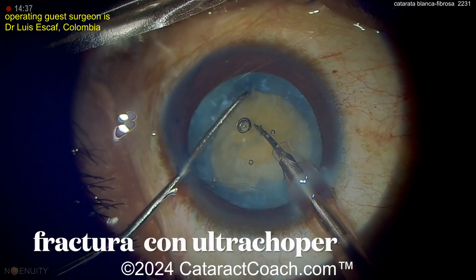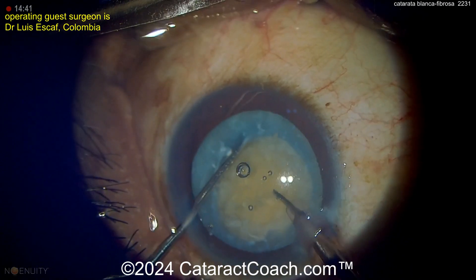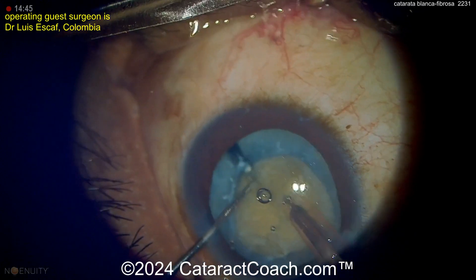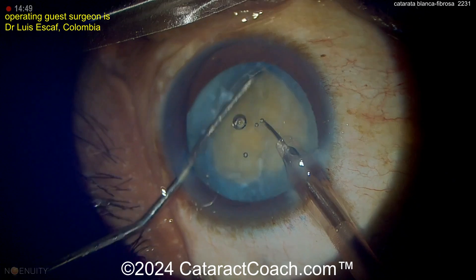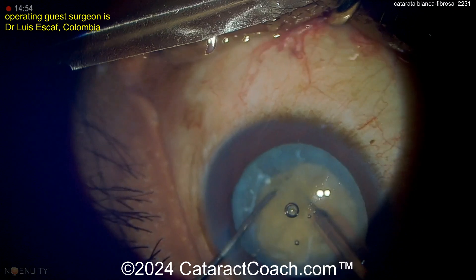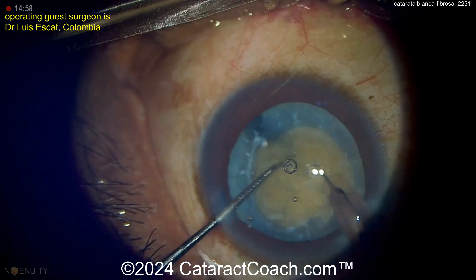Now using this ultra-chopper — this is a very sharp tip that allows you to penetrate the dense nucleus very easily. And then using a chopper in the other hand, you can really split this nucleus. This ultra-chopper is an invention of Professor Escaf, and it's a neat technique. So begin buzzing into the nucleus there, splitting it. There's the chopper.